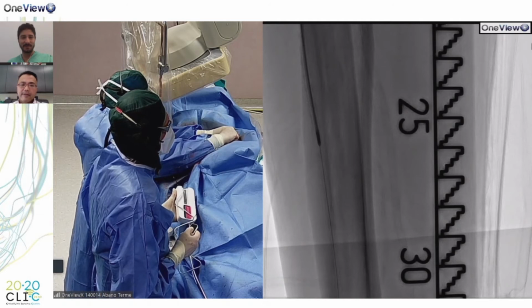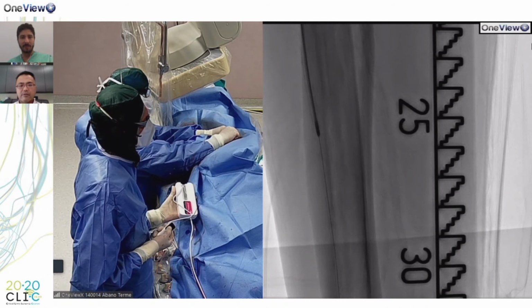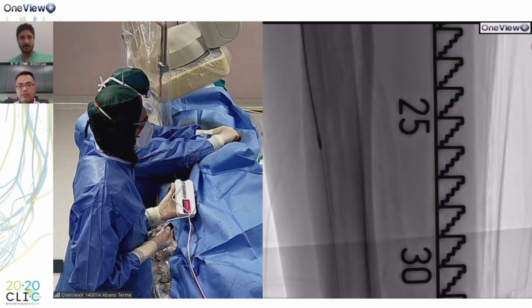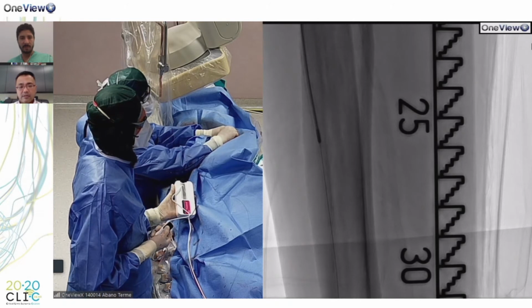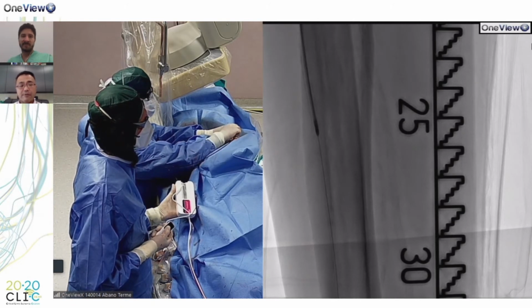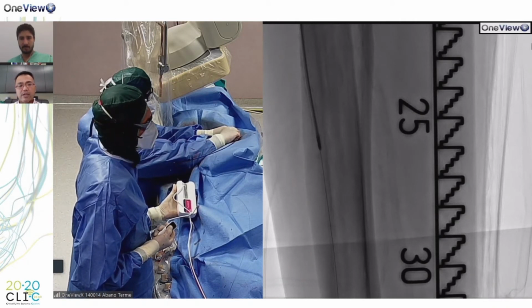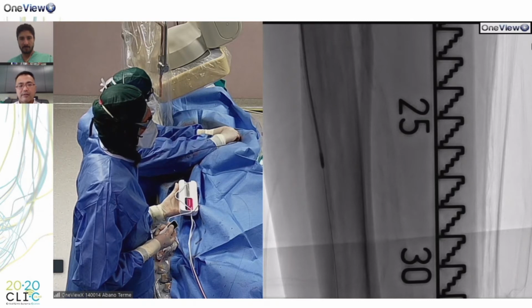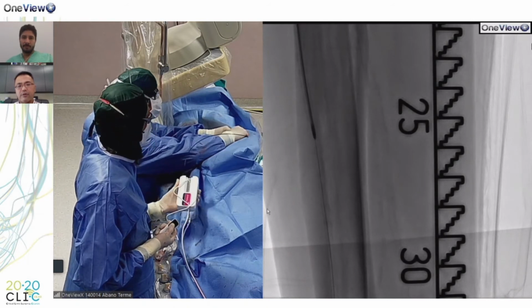Yeah, I think in this case, I must qualify that my experience with below the knee atherectomy, JetStream or otherwise, is not extensive. I must say that in this case, where there's a very tight lesion, maybe the stenotic lesion itself would act as a natural filter to prevent distal embolization. I think the main thing to worry about is to keep it very nice and slow. And hopefully with the aspiration potential of this device, we're able to remove the plaque and change the compliance of the vessel to allow better balloon angioplasty without dissection or recoil.